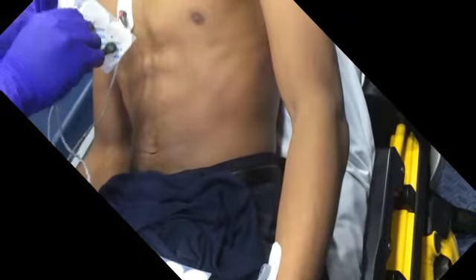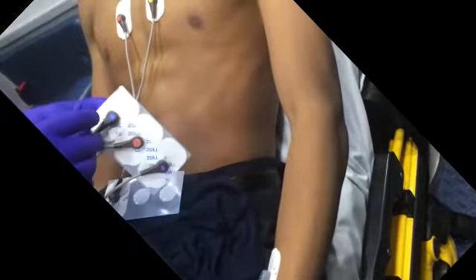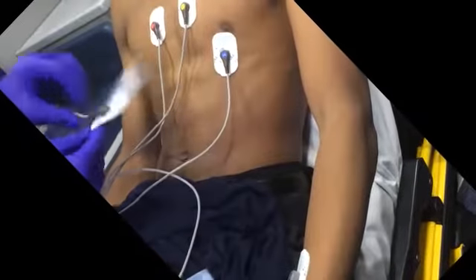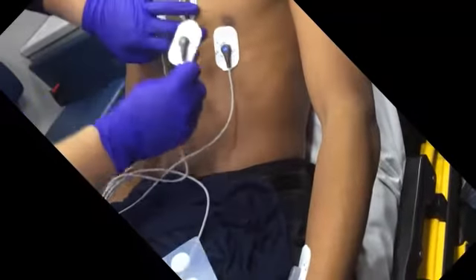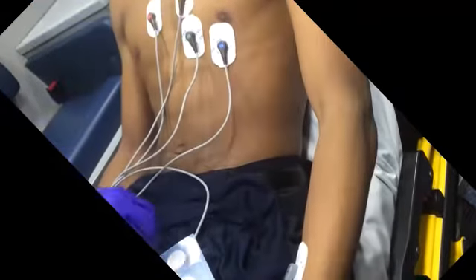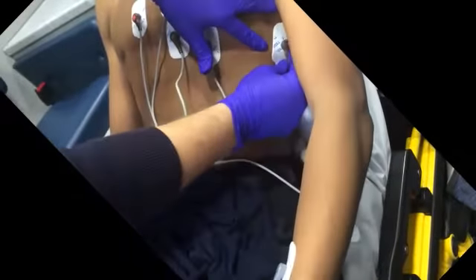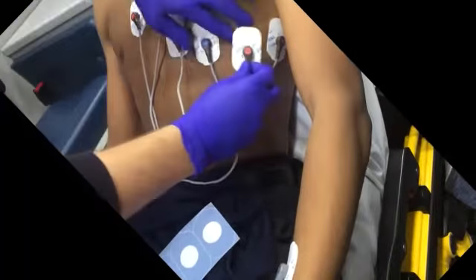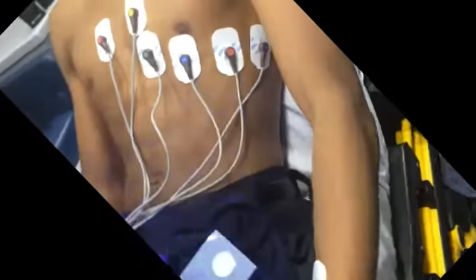The paramedic will then transfer over to the patient's left side, identifying the fourth intercostal space directly on the opposite side of the sternum for V2. The medic then stair steps down to identify the fifth intercostal space, mid-clavicular, and applies V4. Now we go back in between V2 and V4 and apply V3. Along that same line, the medic will then transfer to V6, going mid-axillary. And then, of course, finally, we'll do V5. It falls between V4 and V6.